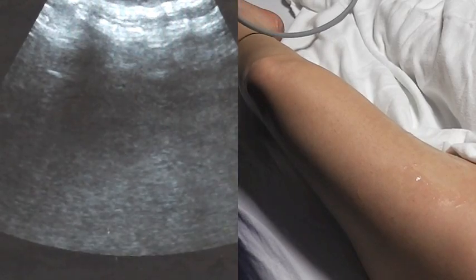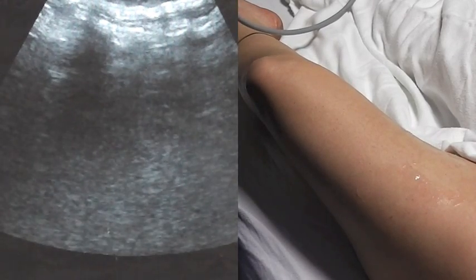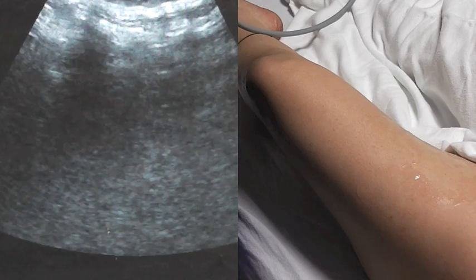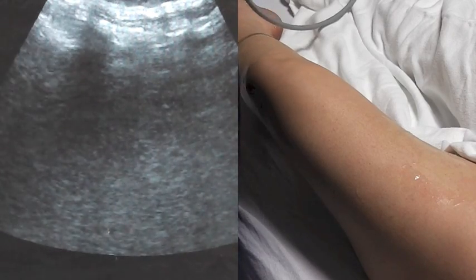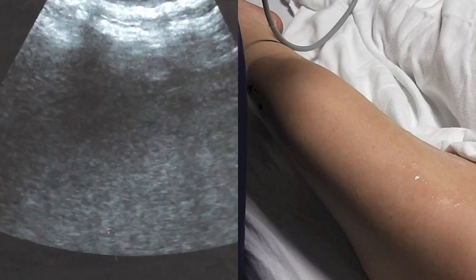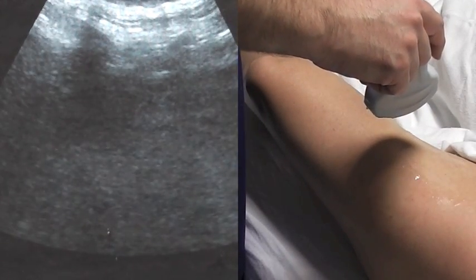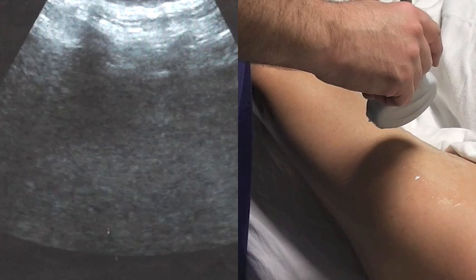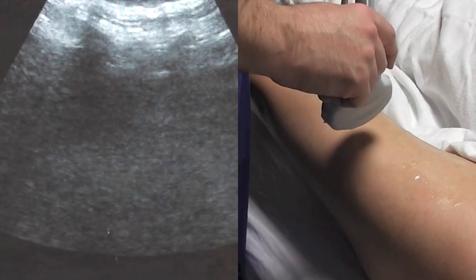For the anterior sciatic nerve block, we have the patient lying in supine position. We're going to confirm our probe position so that we know what is lateral and what is medial. In this instance, the right side of the screen is going to be lateral and the left side of the screen is going to be medial.